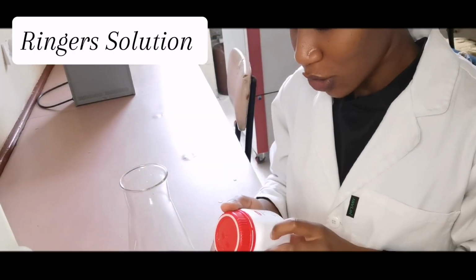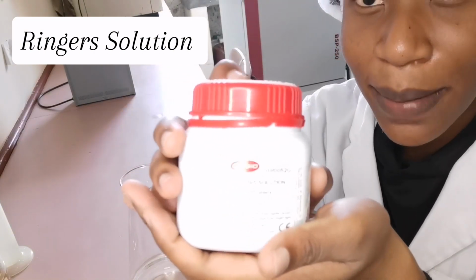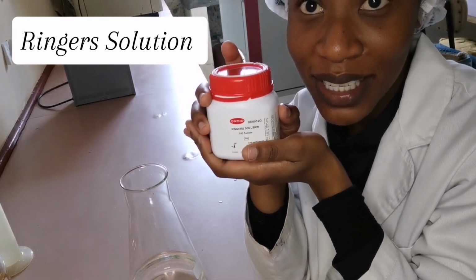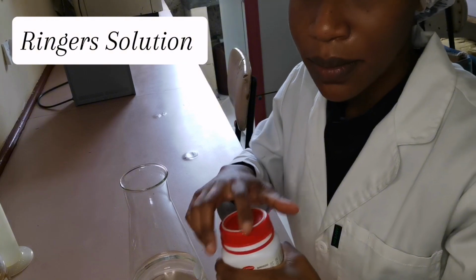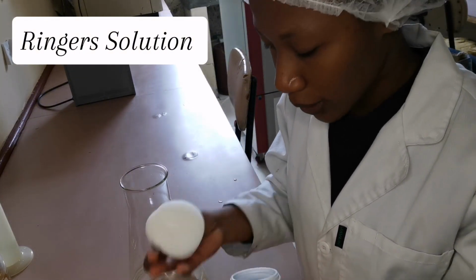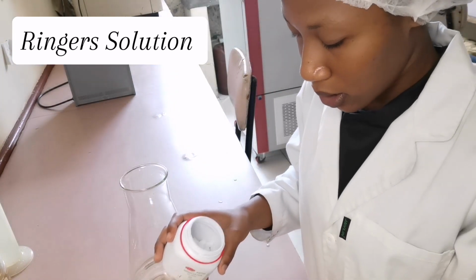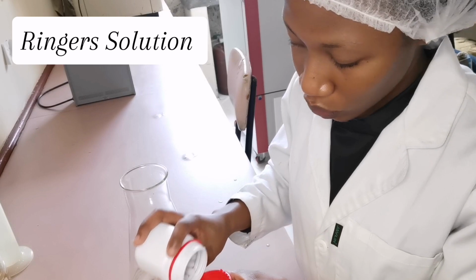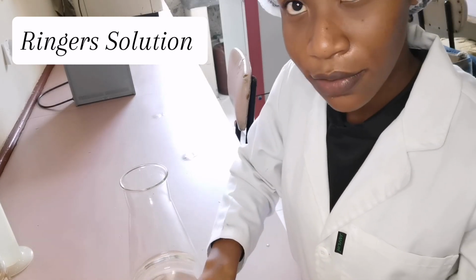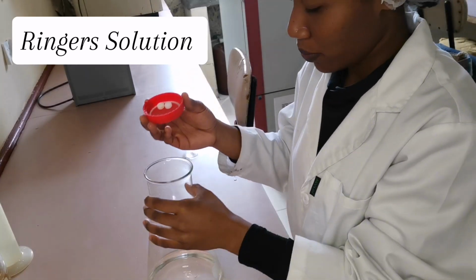Now let's move on to the preparation of Ringer's solution using these Ringer's tablets. Yeah, these Ringer's tablets. So one tablet must be dissolved with 500 milliliters of distilled water, but I want to dissolve 2 tablets. So that means I'm going to be dissolving these tablets with 1 liter of distilled water, like so.